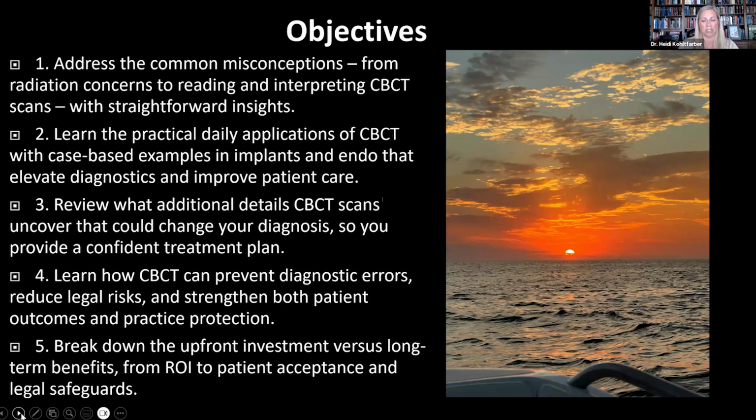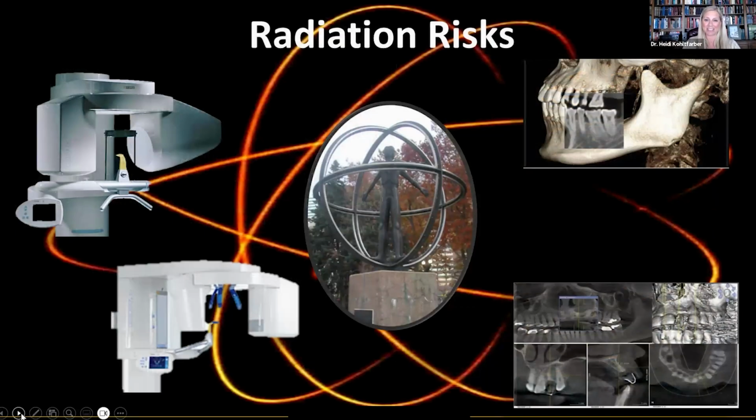And a lot of this can be shown in some of our 2D versus 3D images and cases. And then learn how CBCT can prevent diagnostic errors, reduce legal risks, and strengthen patient outcomes and practice protection, as well as break down the upfront investment versus long-term benefits from ROI to patient acceptance and legal safeguards. Whew, that is a lot to cover in an hour. So we're going to really try to get through it all. I want to make sure that this time is beneficial for you, so I'm going to do my best to finish all of that off in an hour. So definitely be patient with me.